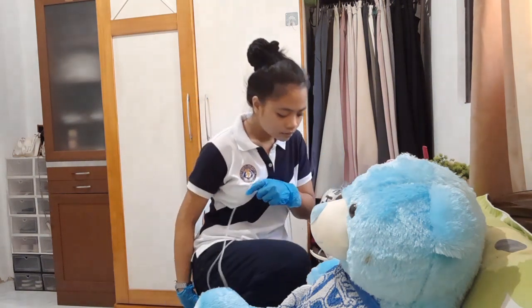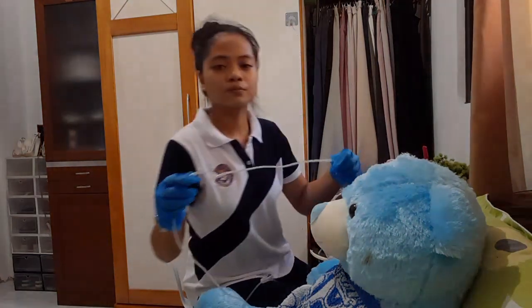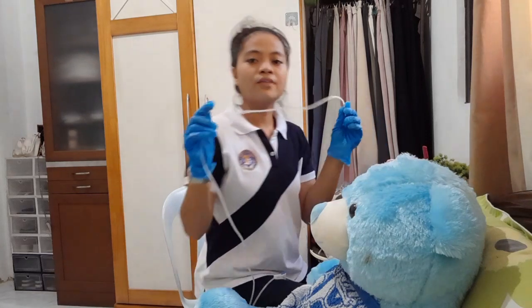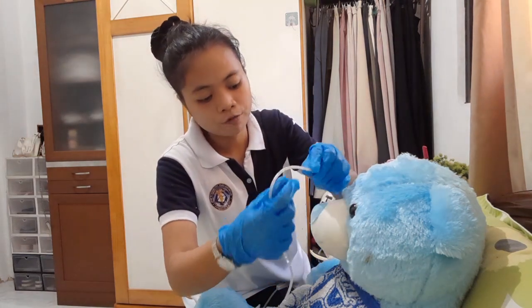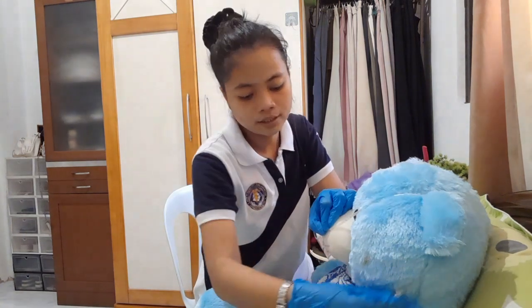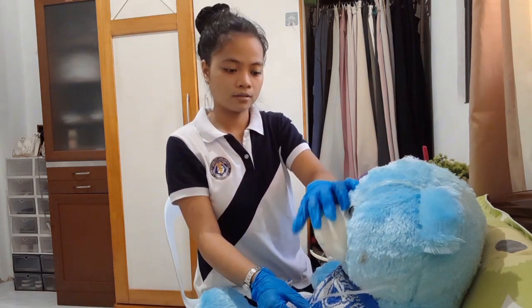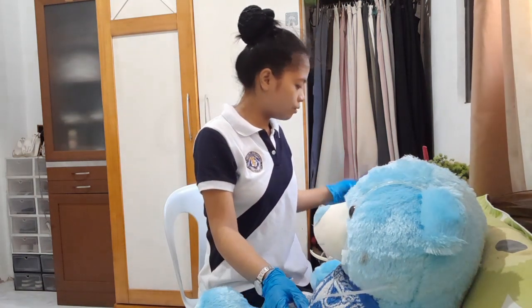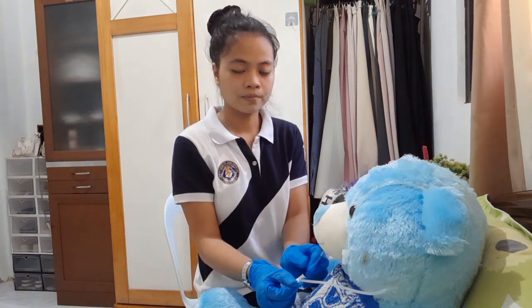Then after that we're going to determine the appropriate insertion length. So by measuring from the tip of the nose to the ear of the client, then here at the stomach. Then we're going to mark the length.